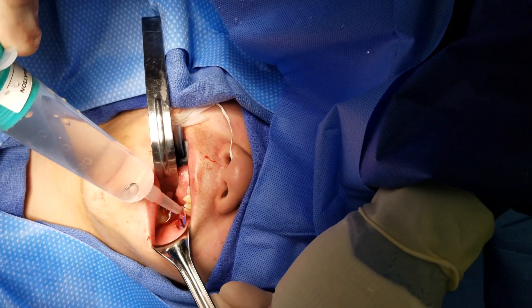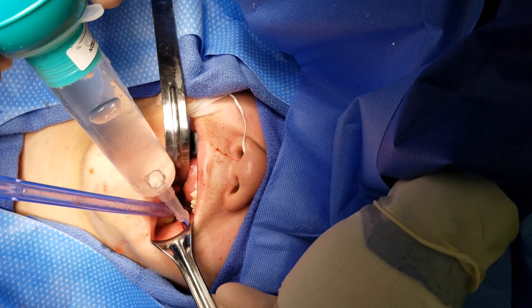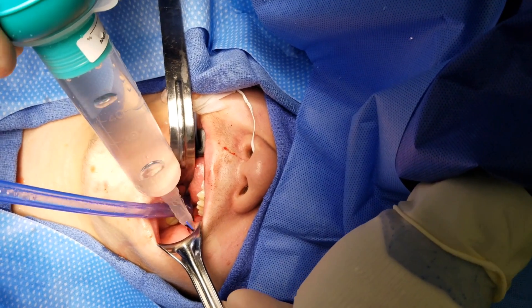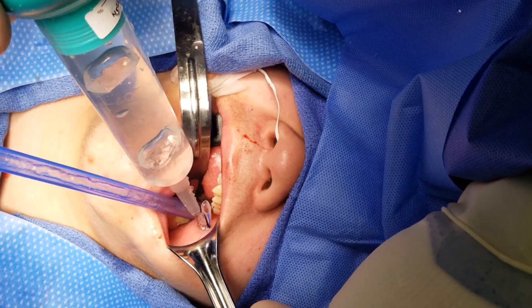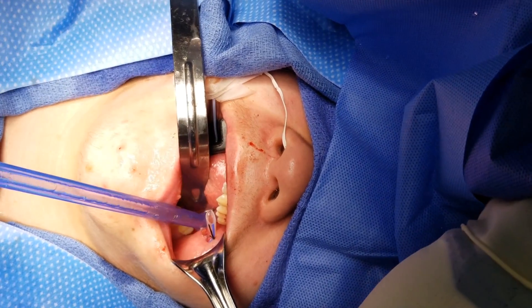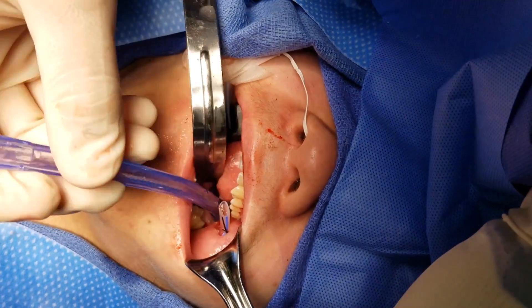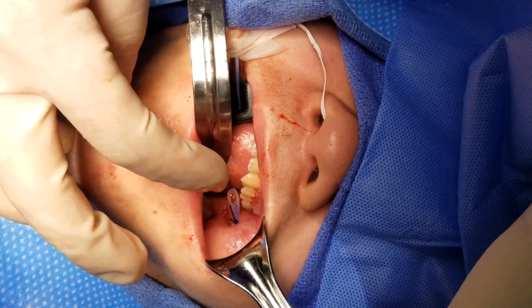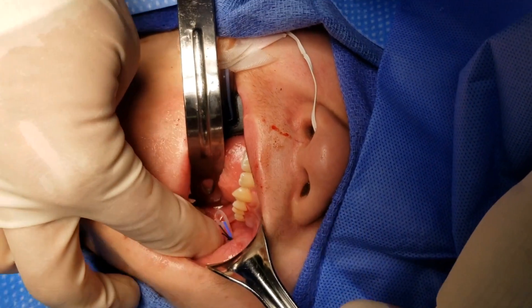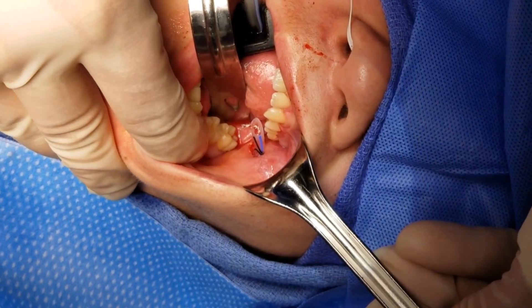Change of mind. Let's see if I can get in here, though. Just shoot a little bit up in there. There we go. All right, there we go. It's a drainage of a kind of somewhat superficial infratemporal space abscess. Thank you.